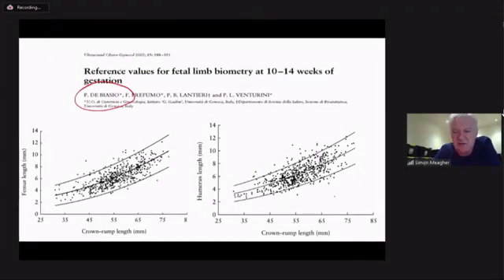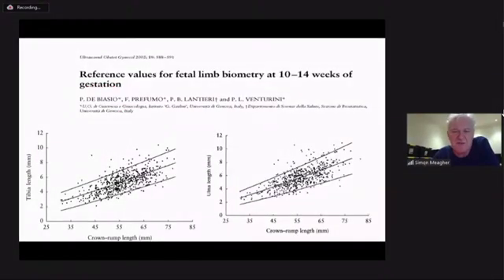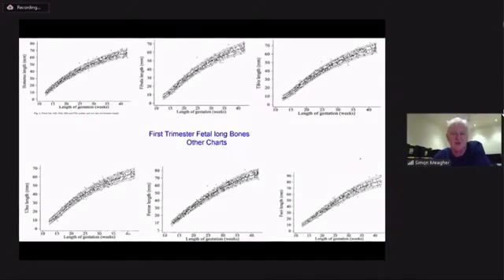And if you look at it there, for around 13 weeks of gestation, you're looking at the mean around about 8 or 9. But if you get up to there, the 90th centile, and if you come down to the 5th centile, you're around about 7 millimeters. So just bear that in mind in your routine screening. But for most, you'll find them at 13 weeks just short of a centimetre.